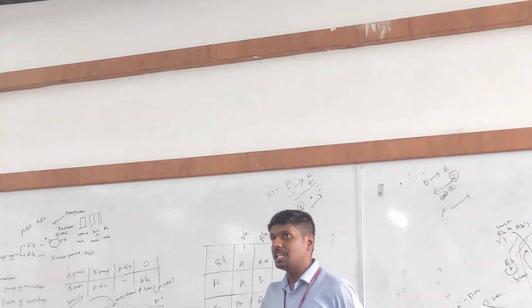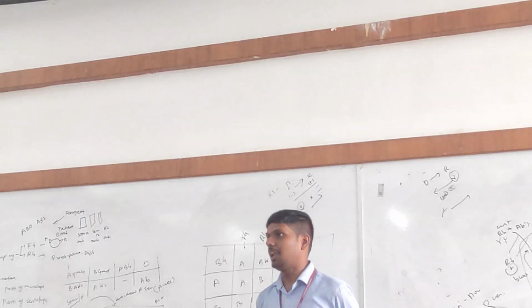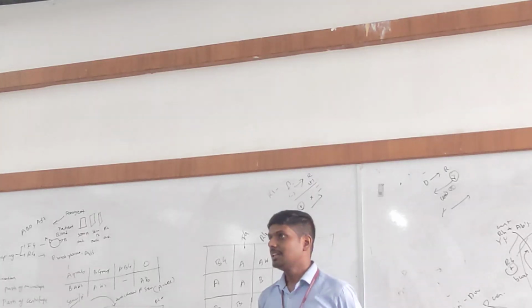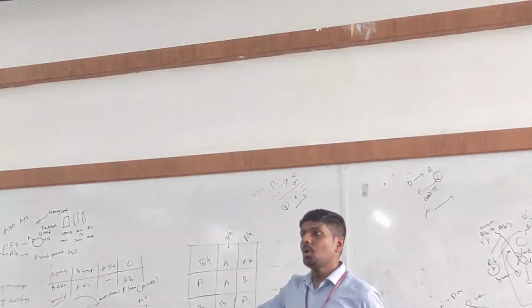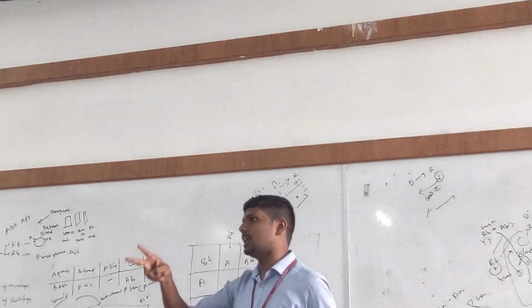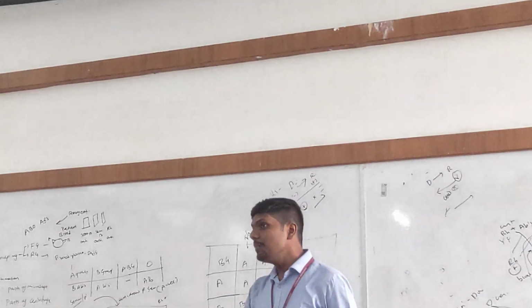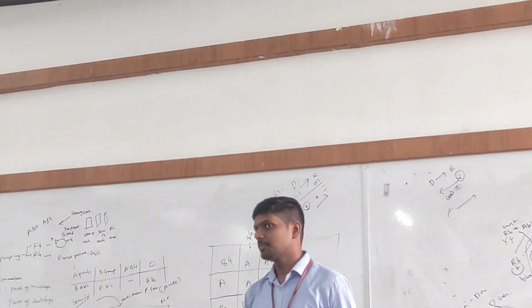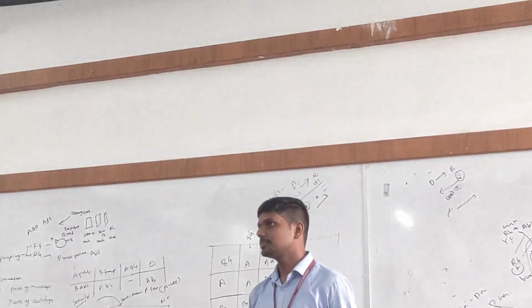So now you understood the significance of reverse grouping, to my knowledge. Why reverse grouping is very important. Got my point? There are some people who have some abnormal antibodies and those antibodies will attack the donor cells. We must check those antibodies also. Got it?